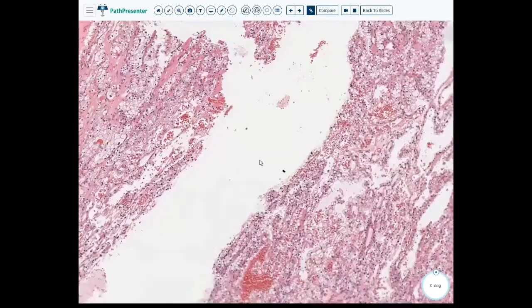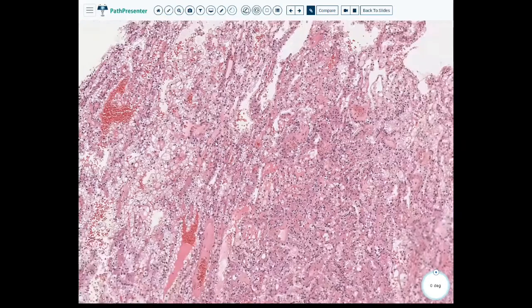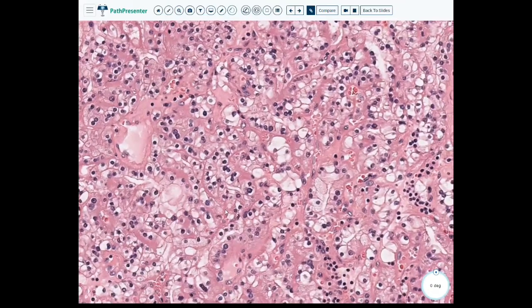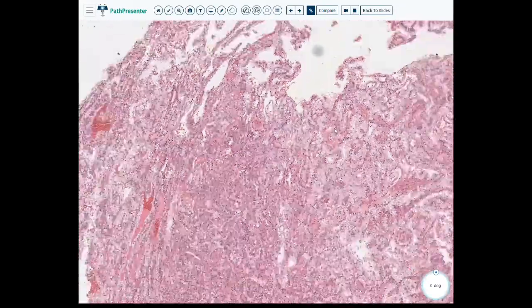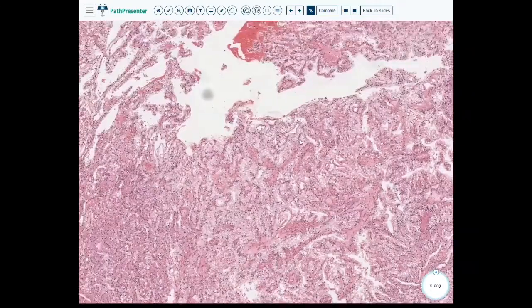And again, kind of the same thing. So we see we have our clear cells, right? Some of them are larger, some of them are a little more pink. And again, these very delicate septae in between. So this is the sense of what your lesion looks like.